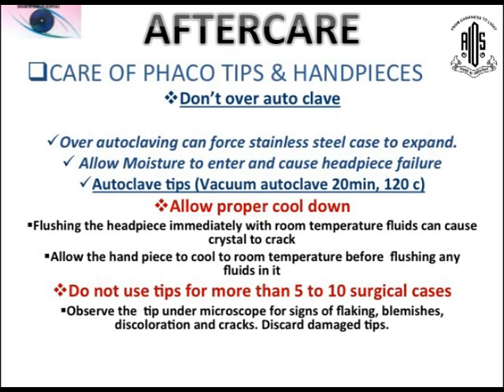Aftercare of the phaco machine is also equally important to prevent any mishap during phaco. Don't over-autoclave, because over-autoclaving can force the handpiece casing to expand and allow moisture to enter and cause handpiece failure. Allow proper cooldown. Flushing the handpiece immediately with room temperature fluids can cause the crystal to crack. Allow the handpiece to cool to room temperature before flushing any fluids through it.